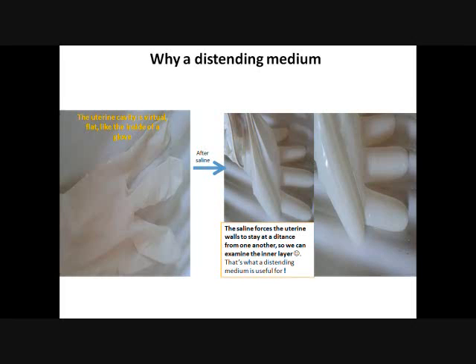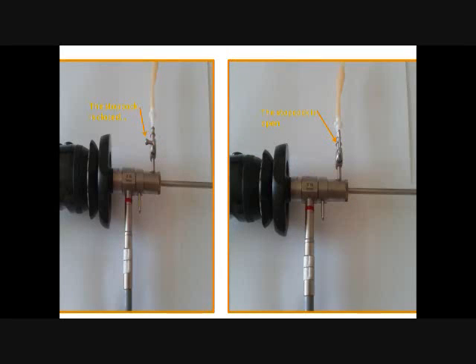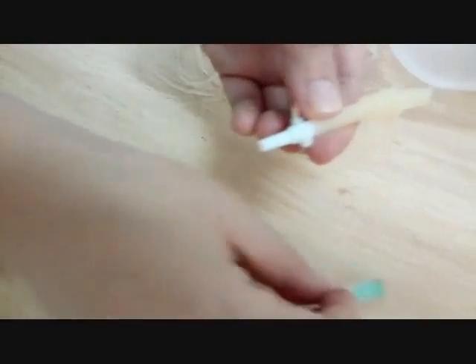Usually we use a normal saline, that's enough. But in operative hysteroscopy, if we happen to use the monopolar energy, then we will have to use glycine instead of saline. Otherwise, saline is widely enough. You should know that there are a lot of distending media, and you can learn more about them in theory. The connector is supplied with a stopcock. The stopcock is closed in the left, so it's perpendicular to the saline. The fluid doesn't flow. On the contrary, in the right picture, the stopcock is open. It's parallel to the saline tube, so the liquid will flow. Here's how we connect the administration set on the sheath.